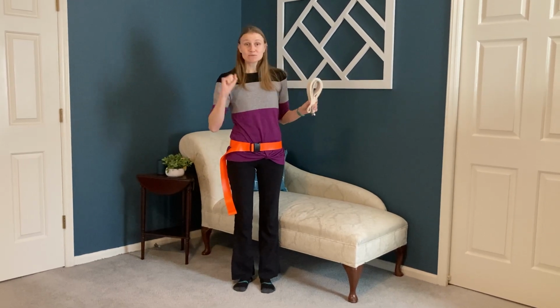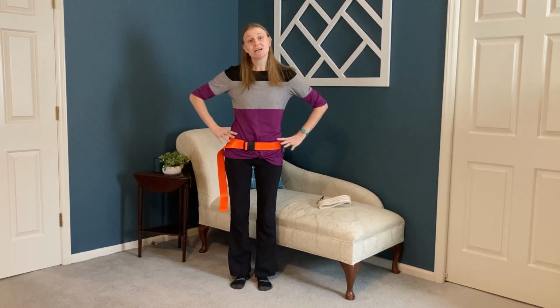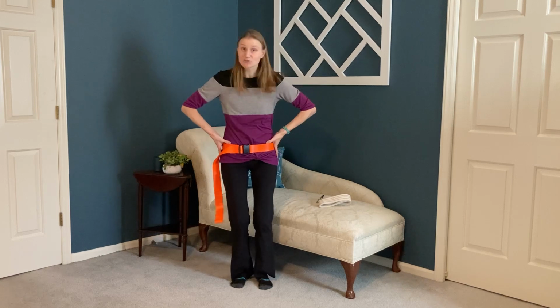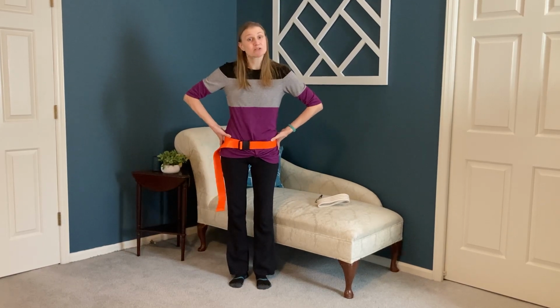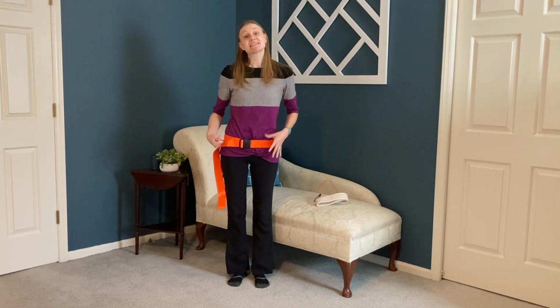So the concept of the gait belt, first and foremost: the gait belt needs to be put on low and tight across the hip bones. My hip bones are right here, the gait belt is right on top of them, so find the hip bones of your clients, put it around there, and get it as tight as it will go.